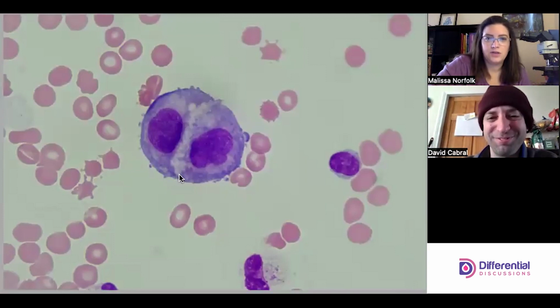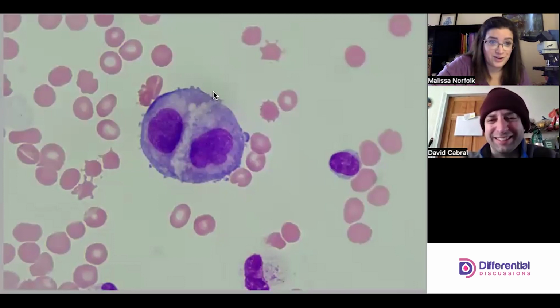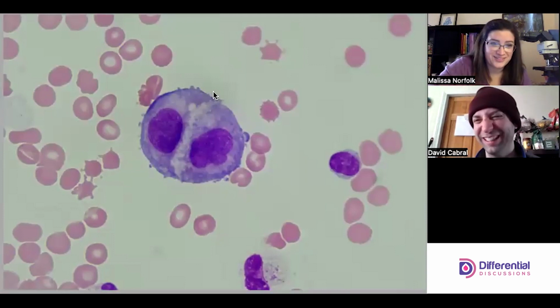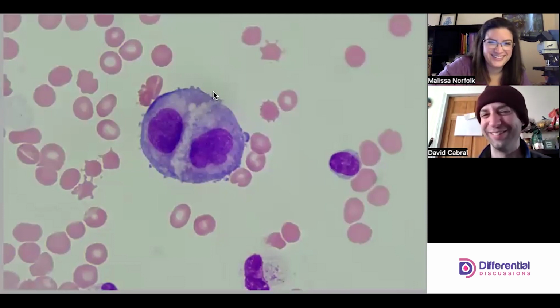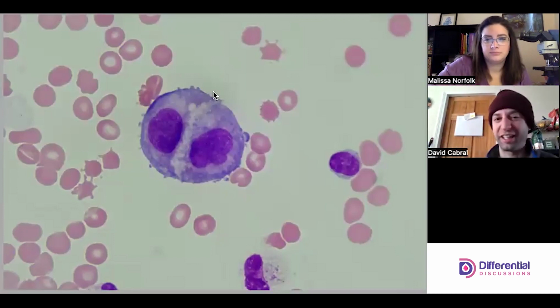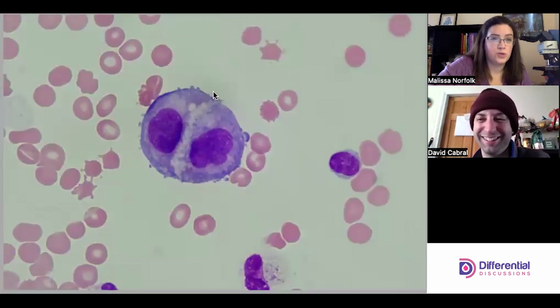If you look here, it does have a window. And it's normal to have a window, but it doesn't look normal. It's a really ugly window. And that's not in itself the only damning feature, right? We can just keep going. Somebody might look at it and say, well, there's a window. But that's one feature that mesos have. You've got to think, well, there's a window, yes, but it's not a nice looking window.